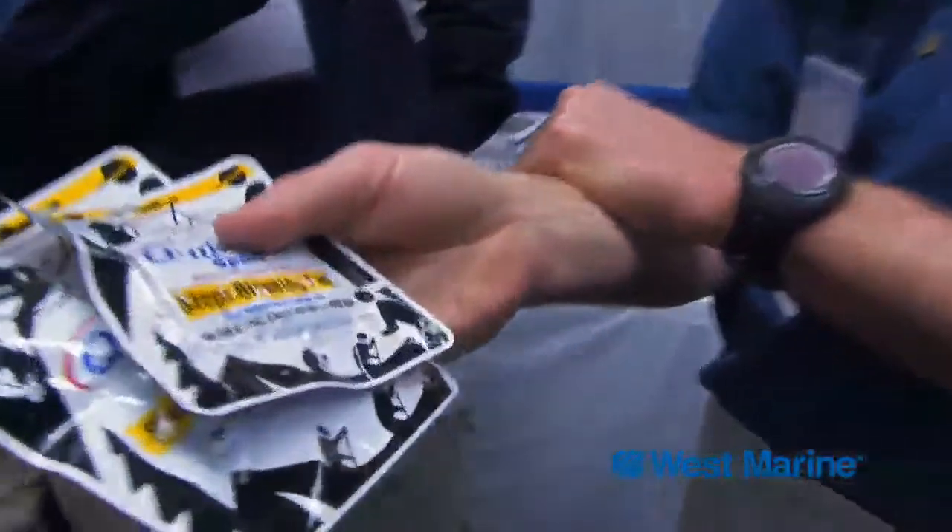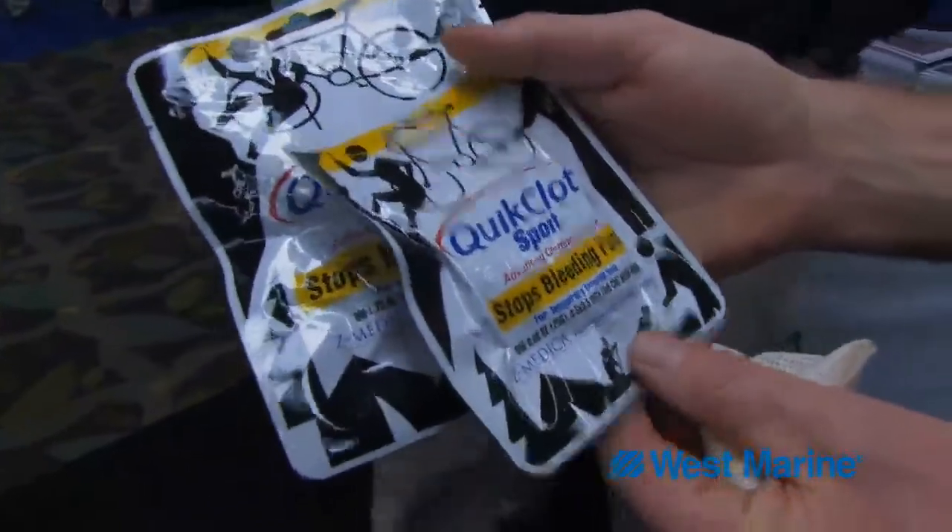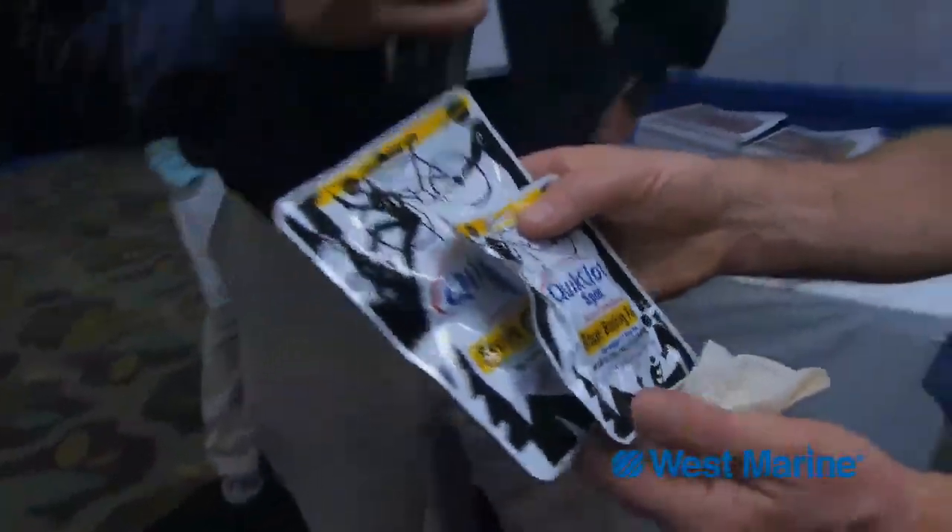So in under five minutes, you could stop a major bleeding wound. This is brand new technology developed to help servicemen in conditions where they have major injuries. It's the choice of the military overseas, all four branches, and they've made this specifically for consumer use.